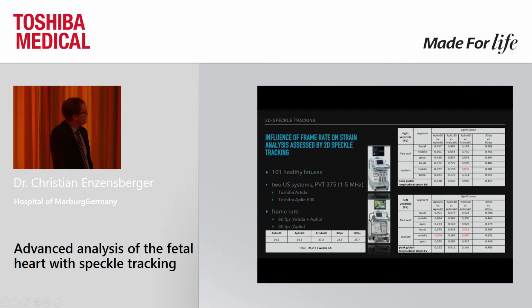Another thing we were quite interested in, and this is always the same, is the question of frame rates. Again, this was already published. Many of these colleagues say more or less that we expect this is because of the need for high frame rates for tissue Doppler imaging. This is something where you need a high temporal resolution, and therefore you can only achieve this by high frame rates. But speckle tracking is different from that. The main part is not temporal resolution, it's spatial resolution.